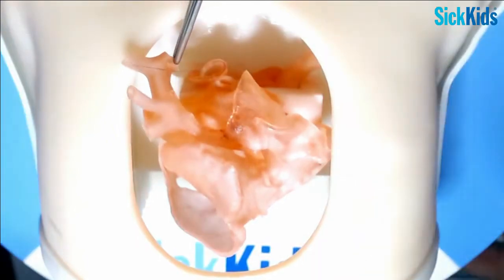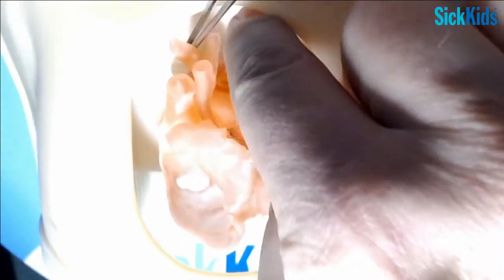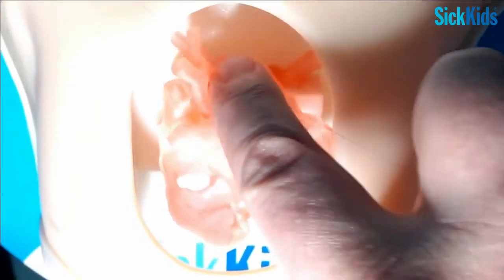Let's put a couple ties here and just do a few interrupteds. And you stitch all that back wall together. Okay, cut that.